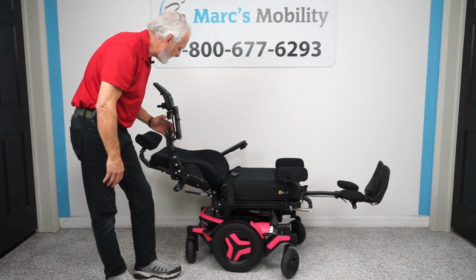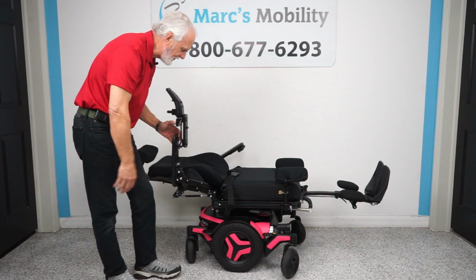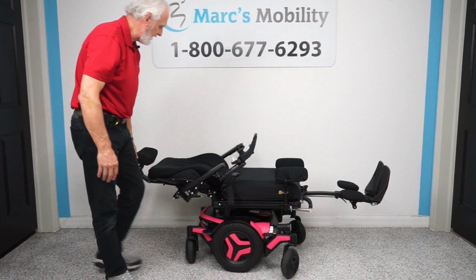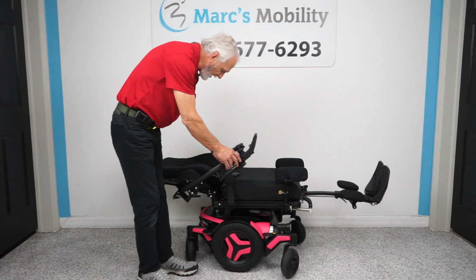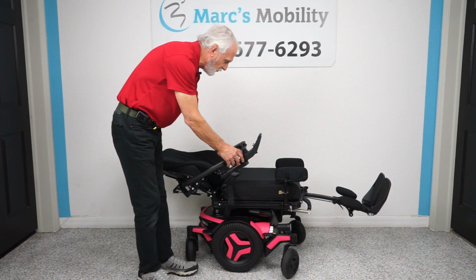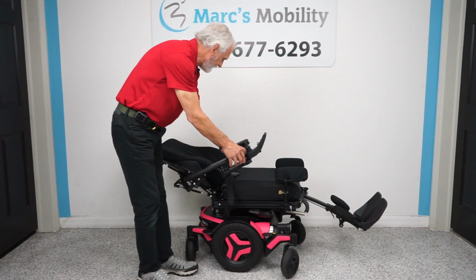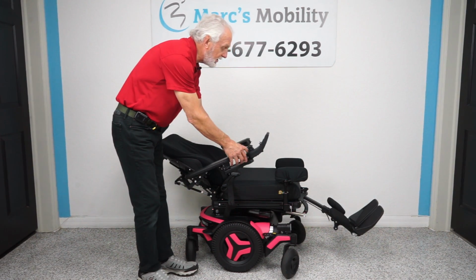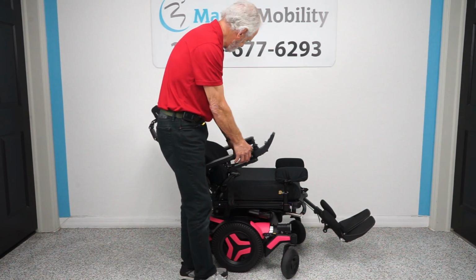So we'll see how far this is going to go. So this one lays flat. So this is what it would look like if you're all the way down laying in this chair. That's what it would look like. So what I'm going to do now is bring the seat back up, and bring the legs back down. I'm doing 2 buttons at once here. You can also do that through the joystick with 1 button. So the legs are coming down, and I'm going to bring the legs all the way in right now to show you something here in a minute.